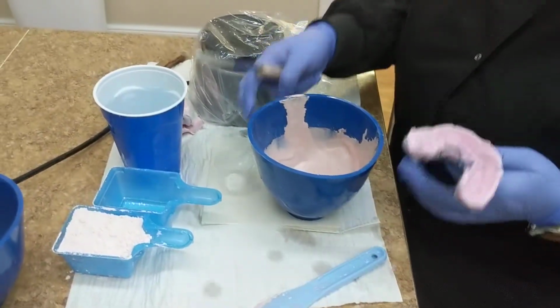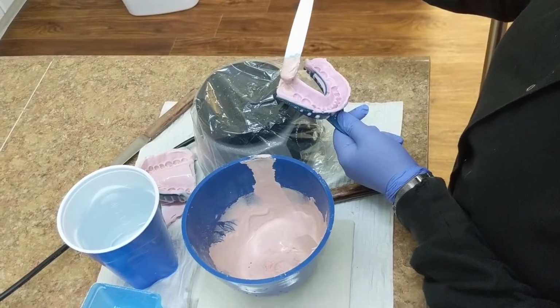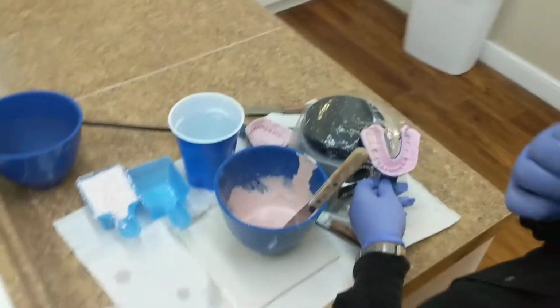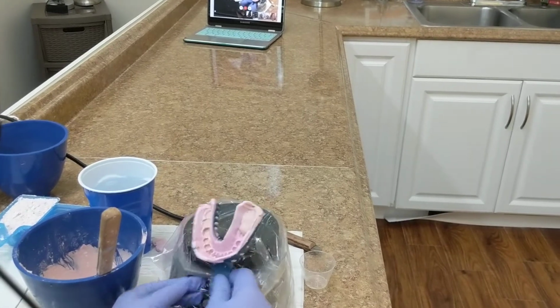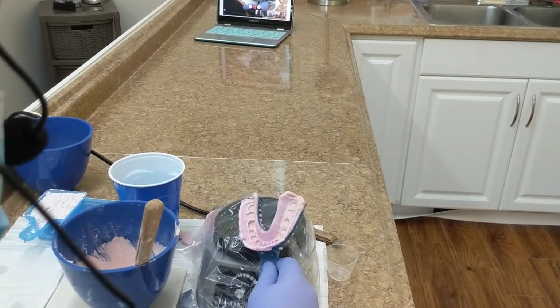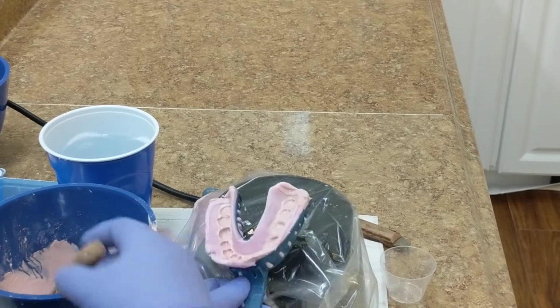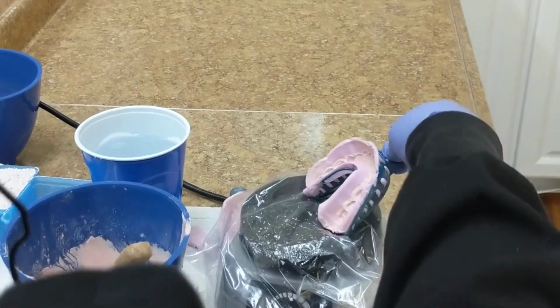So, I always start with the bottom one. You have to go a little bit at a time. Go slow, just to get those air bubbles out. This is the first layer. There are 3 layers to pour an impression. The first one, you want to make sure that all of the teeth have stone on them, but it's not drowning. You want to be able to make this layer of stone, but still be able to see the margins of the teeth. I know it's hard to see like this. I'm just getting some air bubbles out.